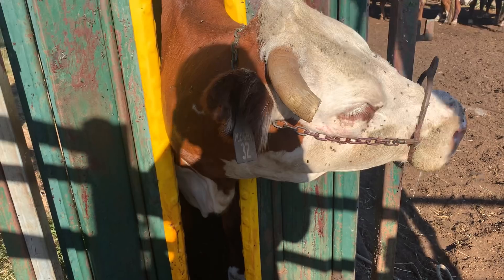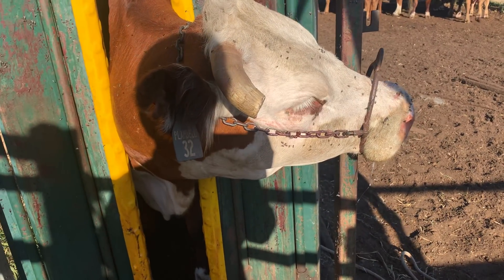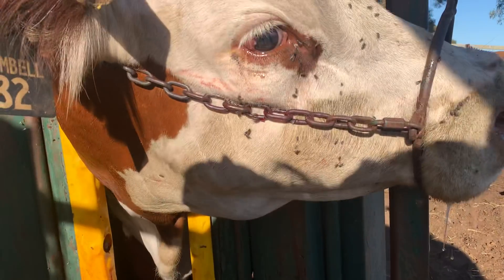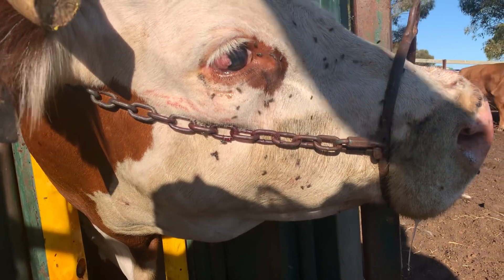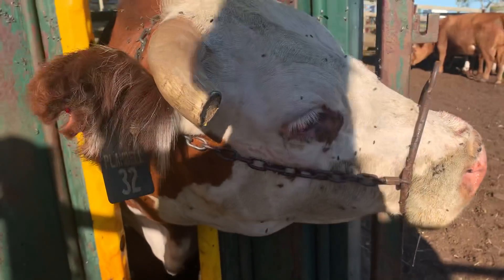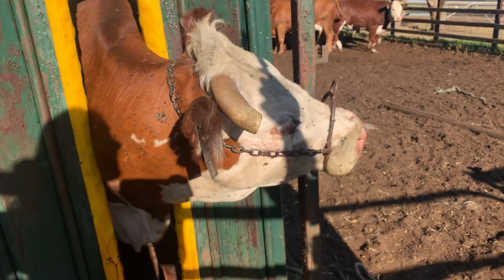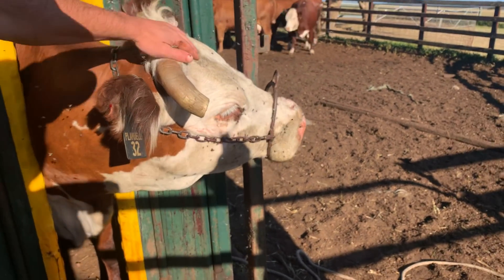If you get it in, you go transversely, but then you pull back to make sure you're in the right spot. I went in the same place — it's about that big. So you probably got it. That's why it was pulling back. Anyway, it'll do a job, especially for this procedure that we've got here.